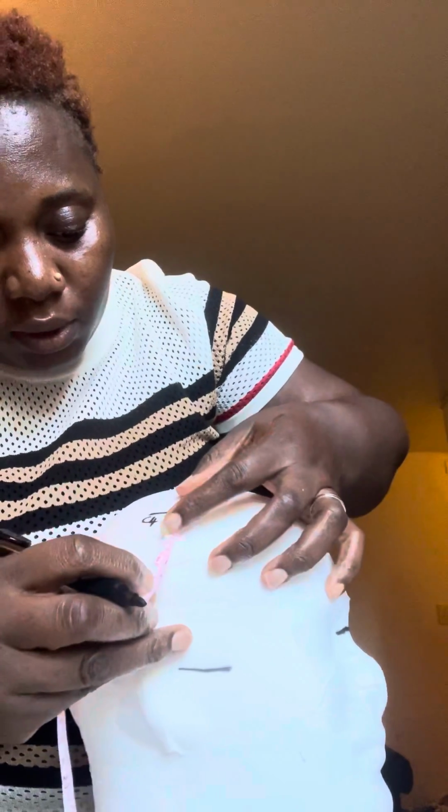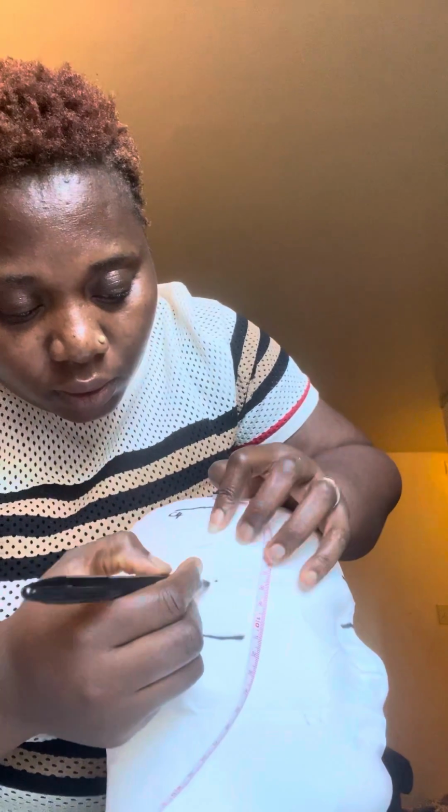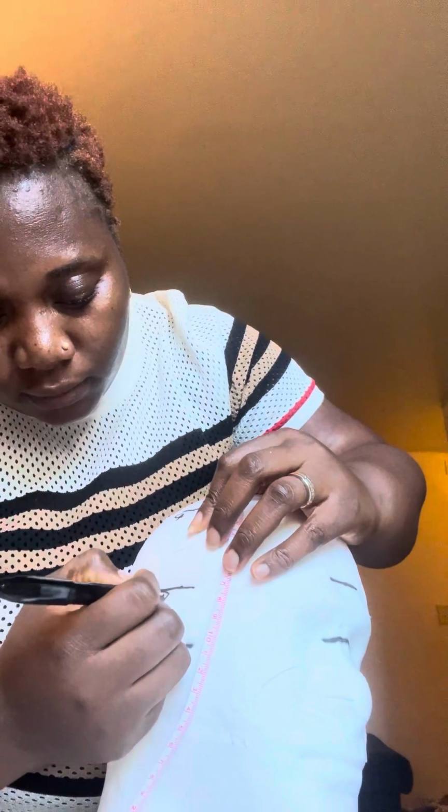C4. Another 20% from your C4, 6.6, is your T4. This is the corona, from left preauricular to right preauricular.